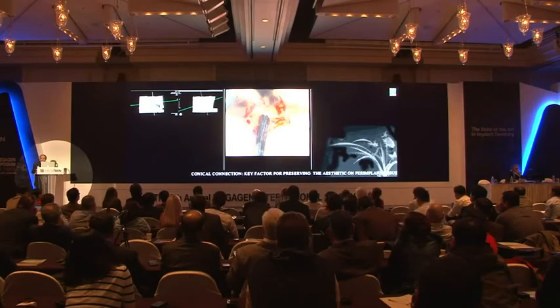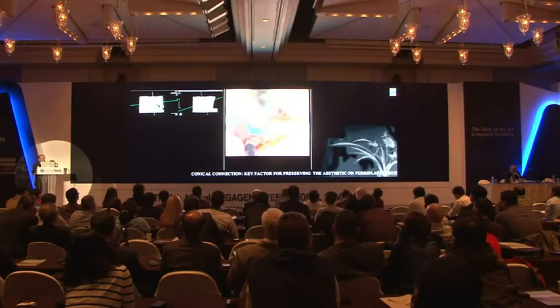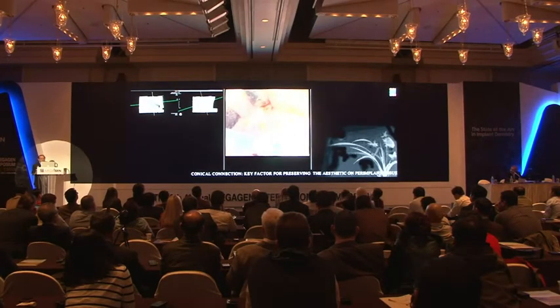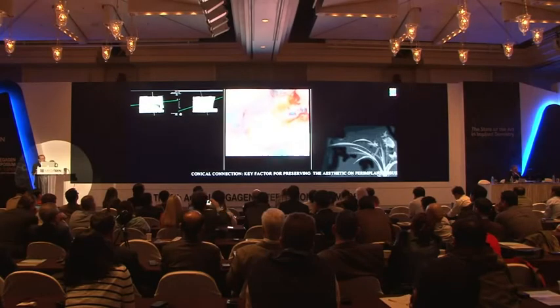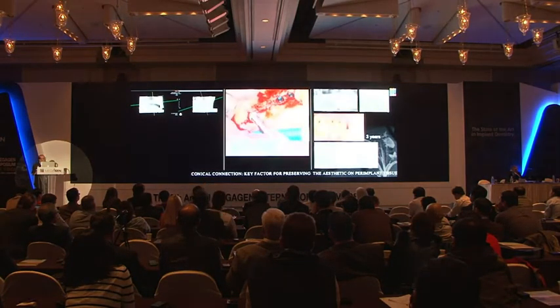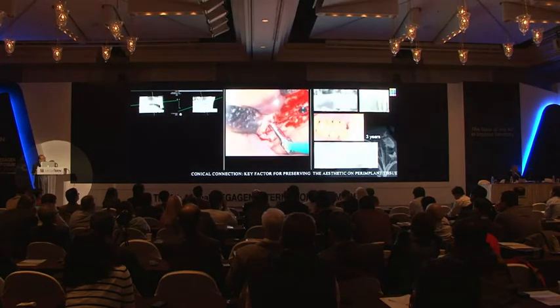You can use a computer guide, yes I know, but I prefer to draw on the bone the anatomy of the maxillary sinus, and then after placing 2 implants in the premolar area, I tilt the drill distally and then I position the implant, avoiding in this way the maxillary sinus itself. This is a post-sinus tilted implant.